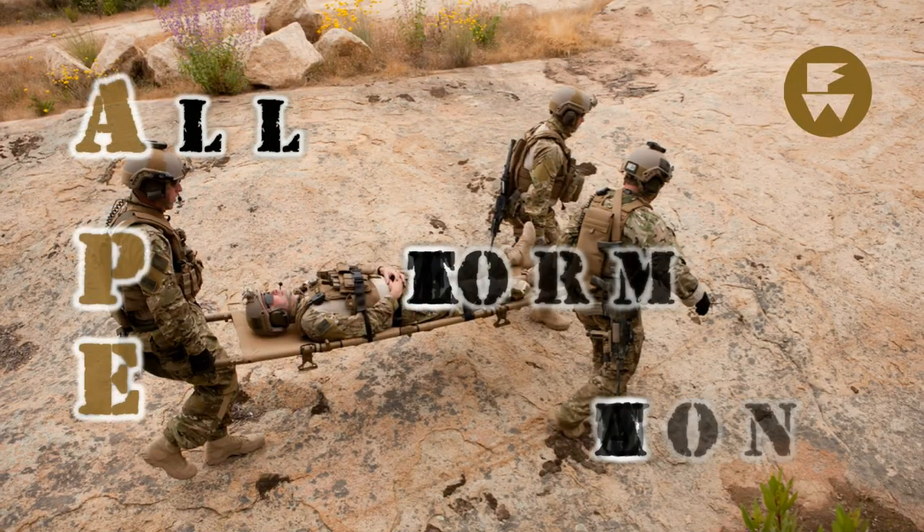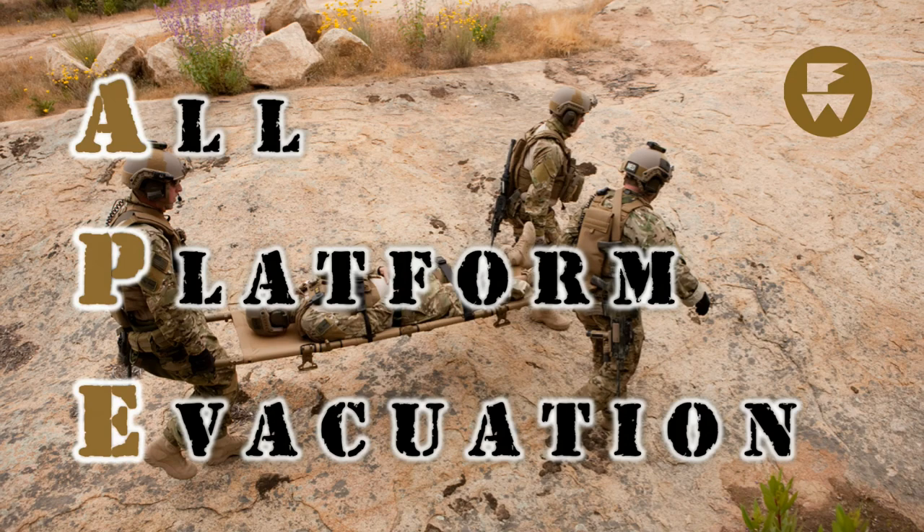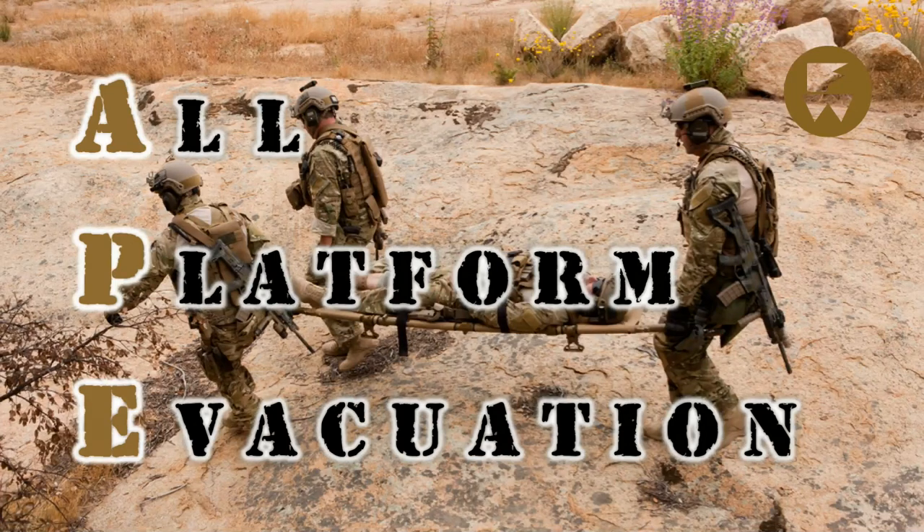The APE all-platform evacuation litter from Ferno Military Systems is a quad-folding rigid litter designed for your tactical evacuation needs. Whether your patient needs to be transported overland, by ground vehicle, aircraft, or watercraft, the APE will accomplish the mission.